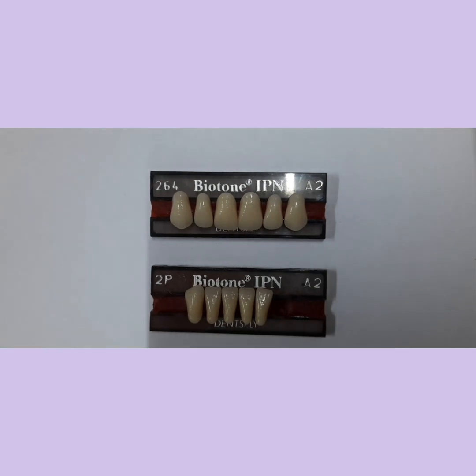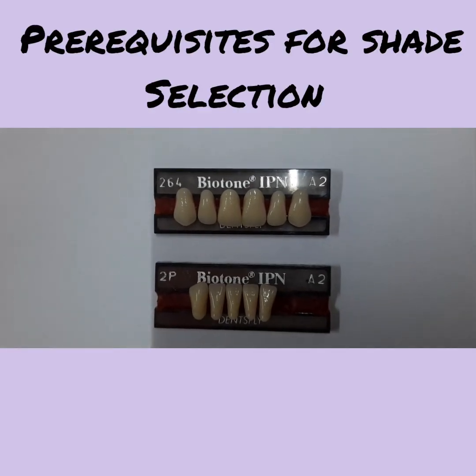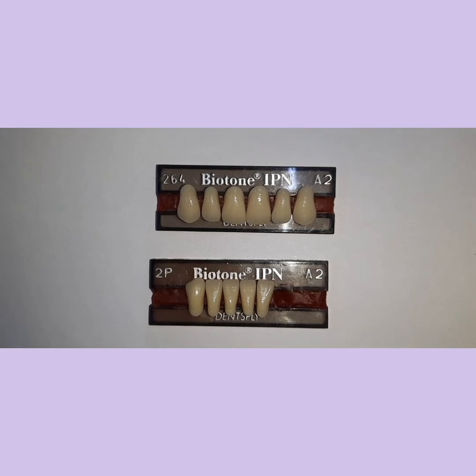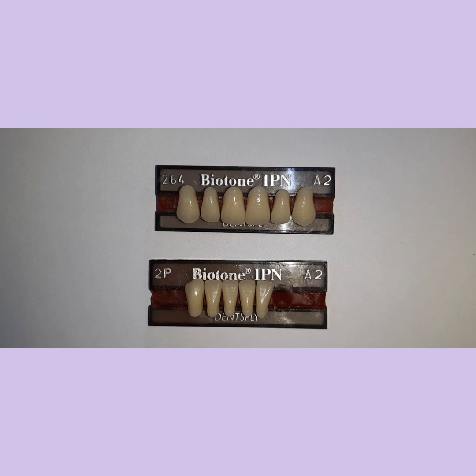So what are the prerequisites for shade selection? Whenever you are doing shade selection, first ask the patient to sit straight. For the teeth which we have to visualize or select, make sure that the doctor stands in such a way that his plane of vision is perpendicular to the surface of the teeth.